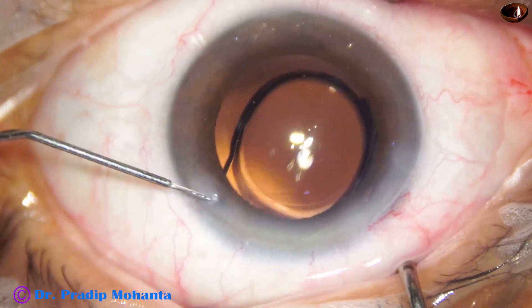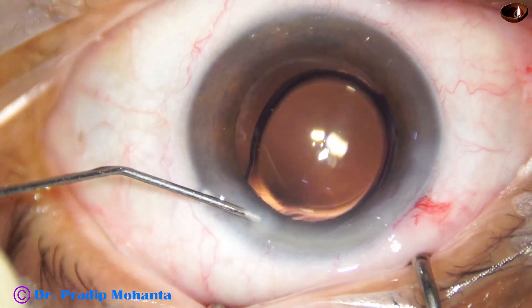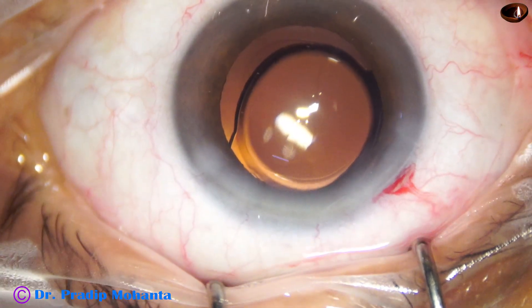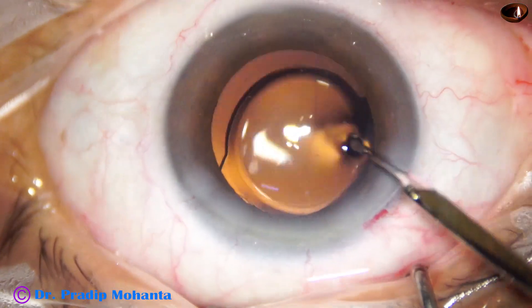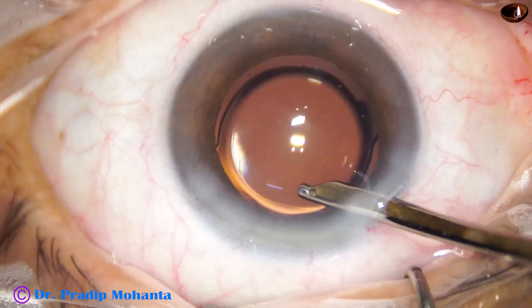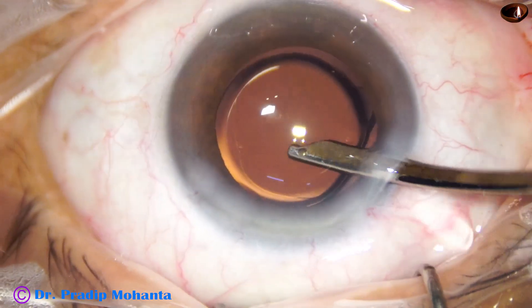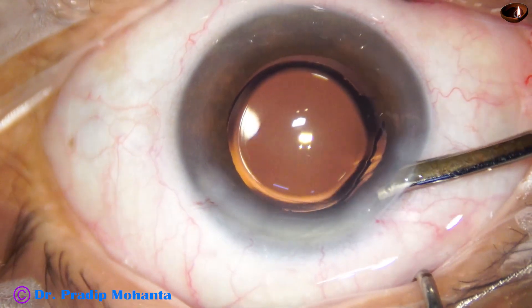Now this is closure of the side port, followed by the final lavage of the anterior chamber. The anterior chamber is then nicely formed.